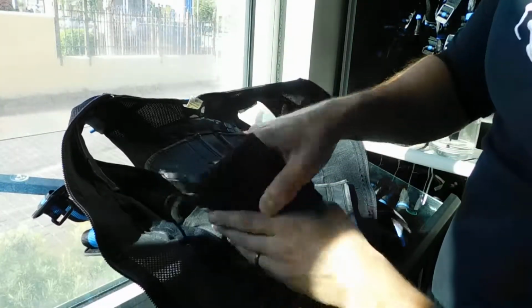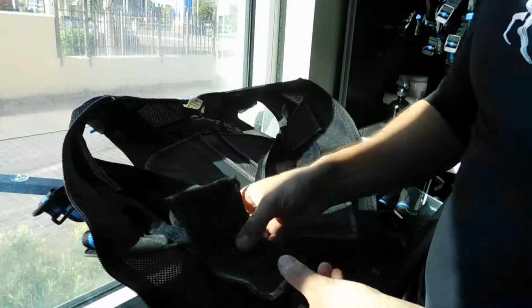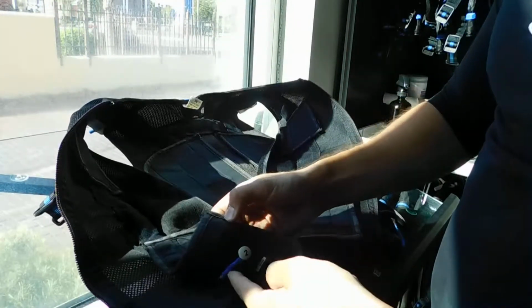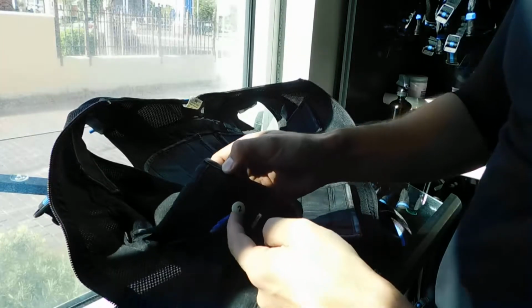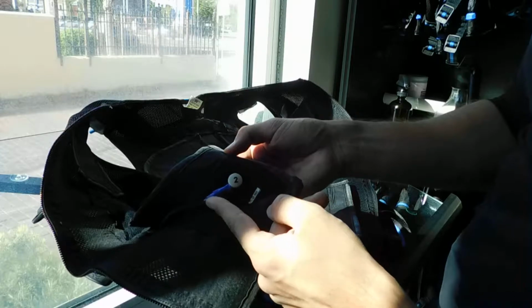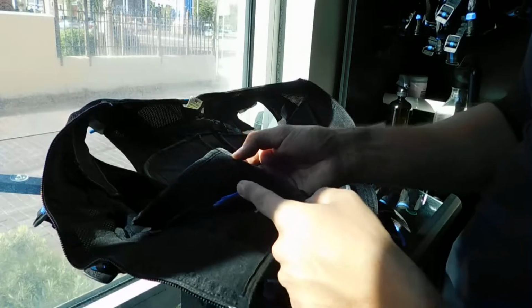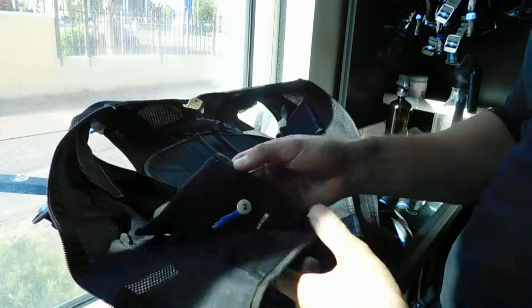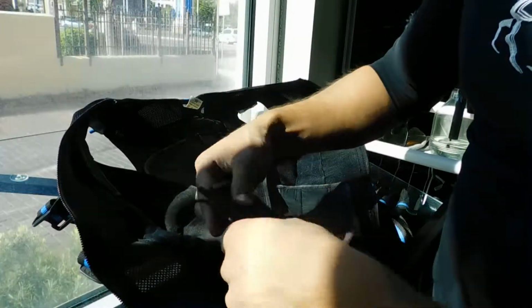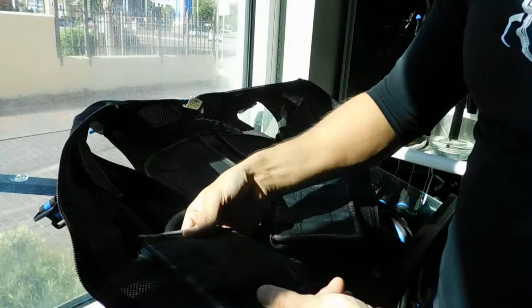So it cannot be like this. If it's this way, when you crunch right here, it's actually breaking the cable right in this area. So this is the most sensitive part of the whole cable. So this always has to be facing up, okay? Because otherwise it will break the cable. So make sure you turn it around, make sure this is nice. You put it down where it should be.